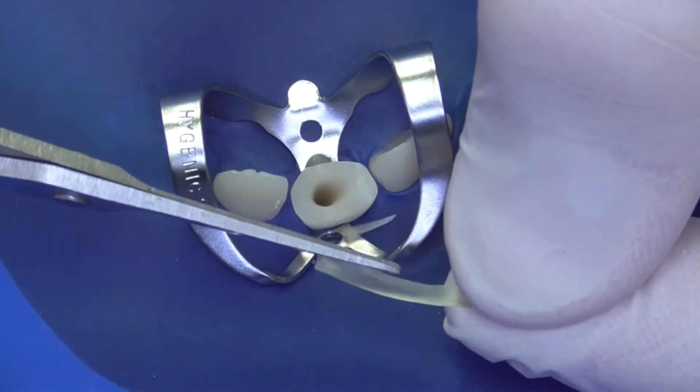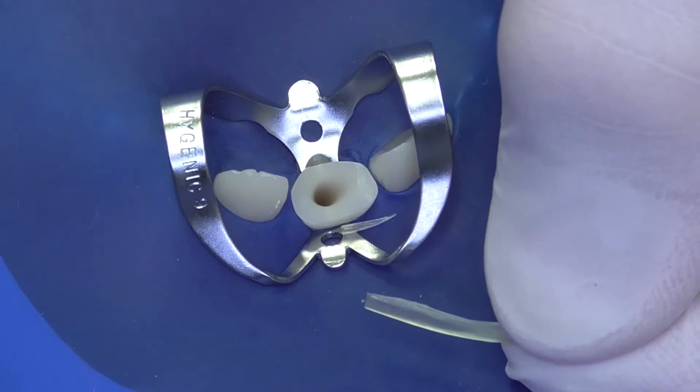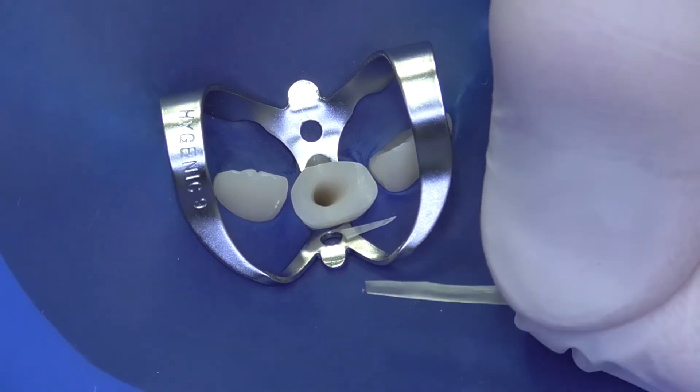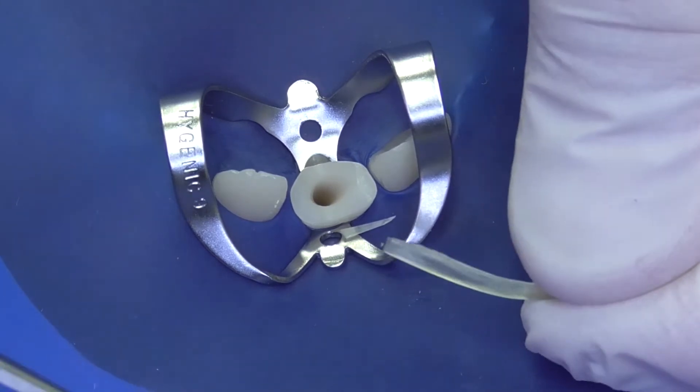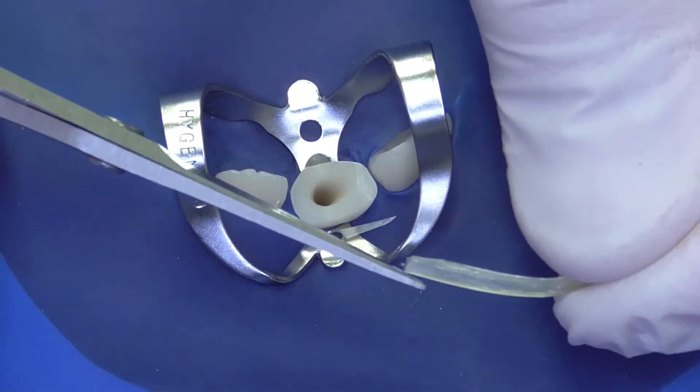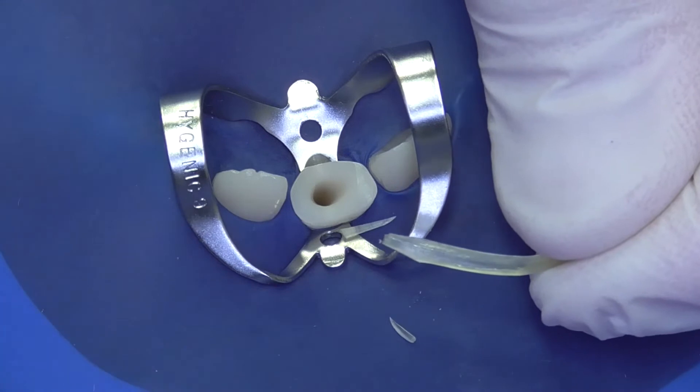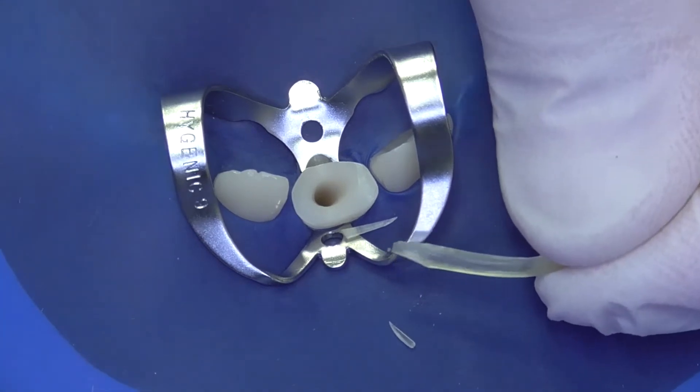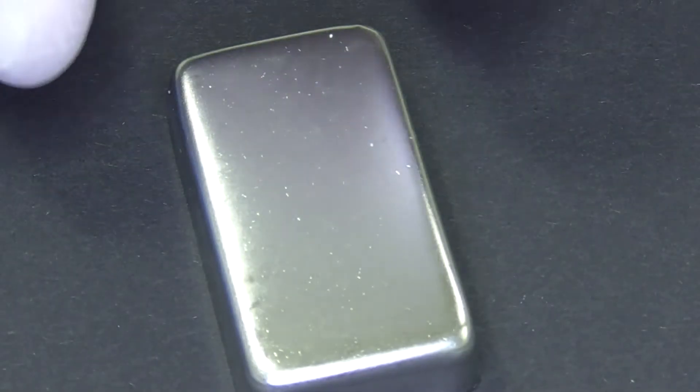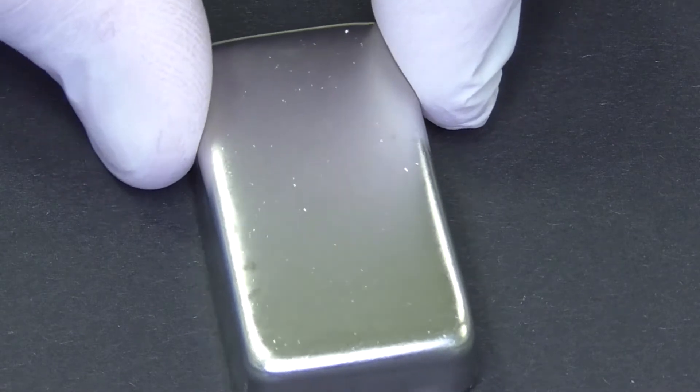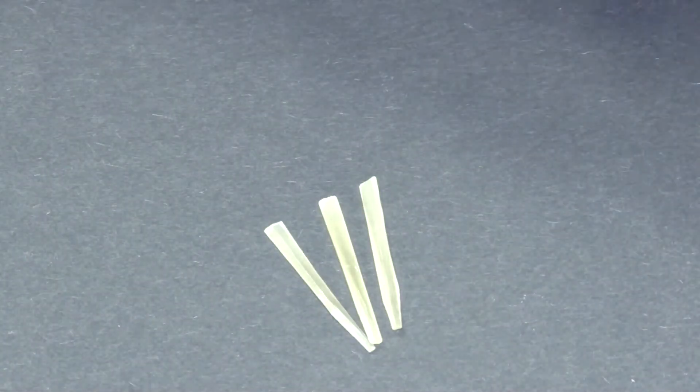So our aim is to optimize the quantity of fibers, most importantly in the coronal part of the root canal. Pieces of the fibers are protected from light under this metal cup prior to cementation.